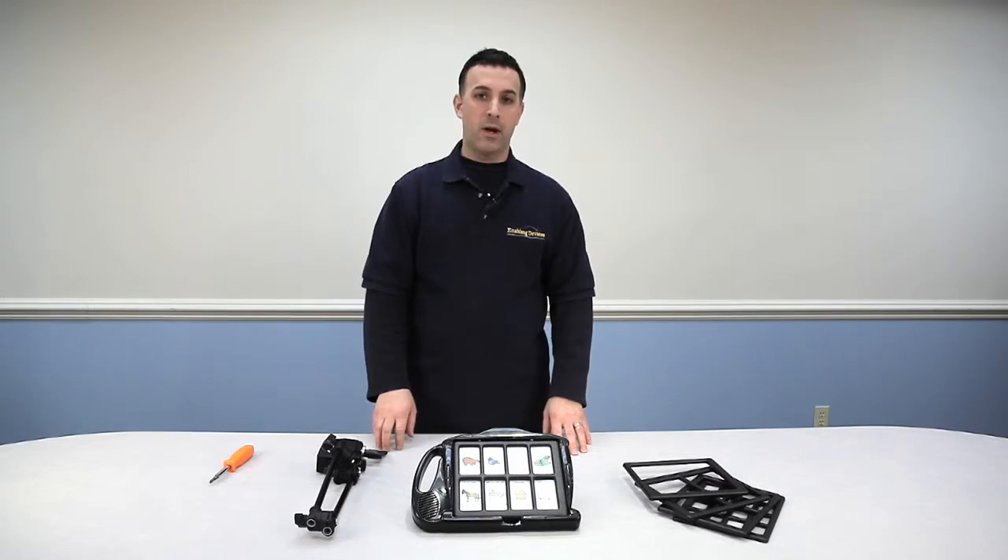Hi, Vinny Lavoie here, tech support at Enabling Devices. Today I'd like to talk to you about one of our new items, the Mountable 7-Level Communicator, item number 7075X and 7075M. So let's get started.